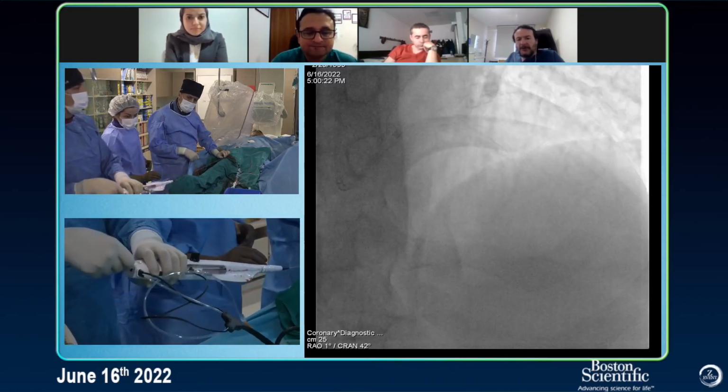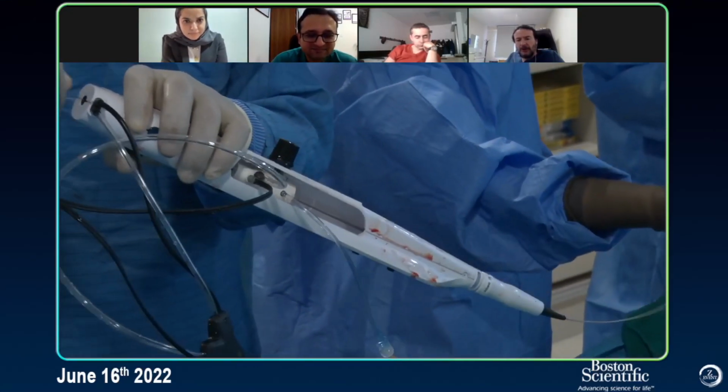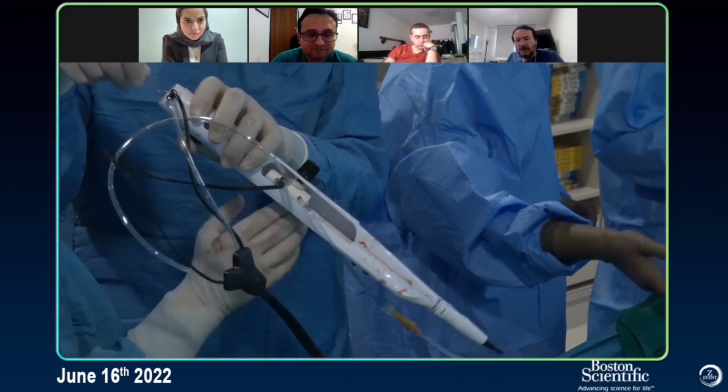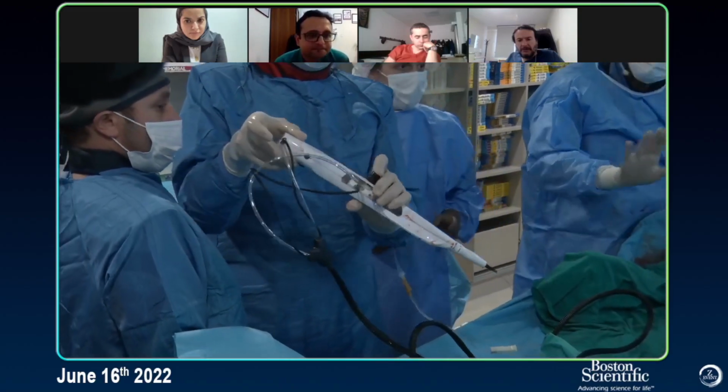The dynaglide should be pressed until the burr comes out. If you do it early, then the burr gets stuck again on the wire. So you have to pull everything out. Exactly. Stop. Very nice.